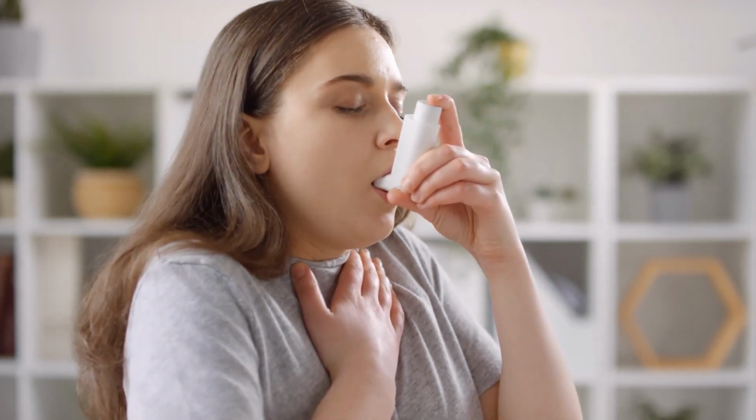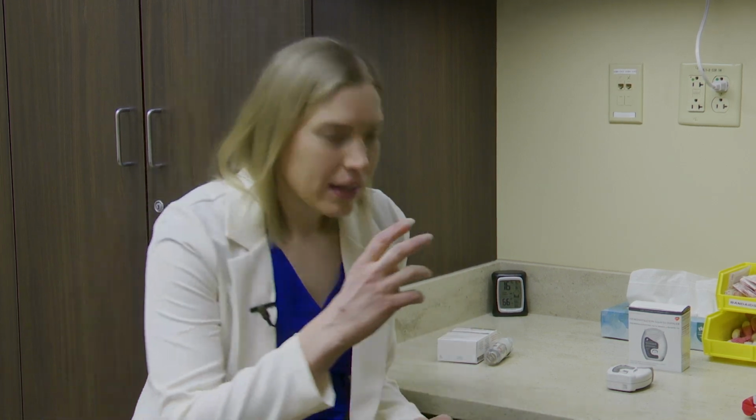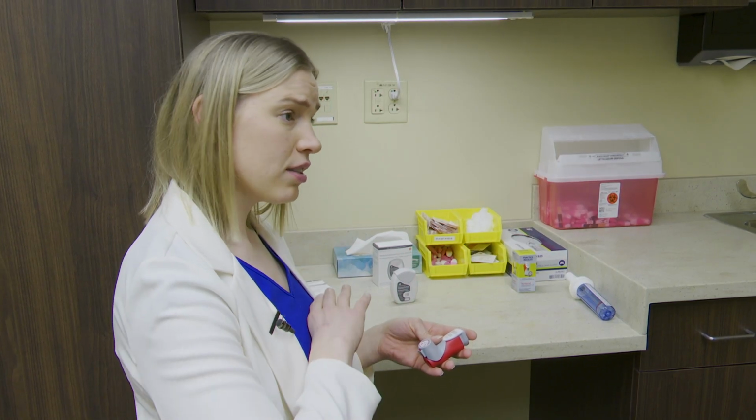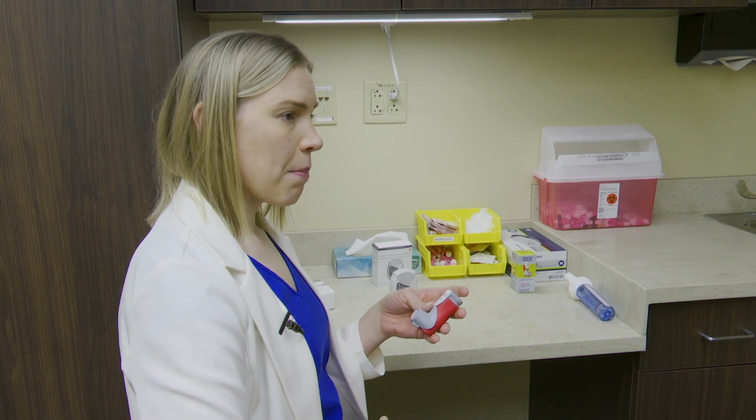Van Klompenburg says she sees many mistakes when patients start using inhalers. The first one is sitting hunched over when administering the medicine. A lot of times they're very embarrassed about it, so instead of sitting upright with the lungs big and open, they're hunched over and trying to breathe it in. And when you have compacted lungs, the medication doesn't get into our lungs as well when using an inhaler. Instead, make sure your back is straight, your chin is lifted, and exhale before taking a puff.